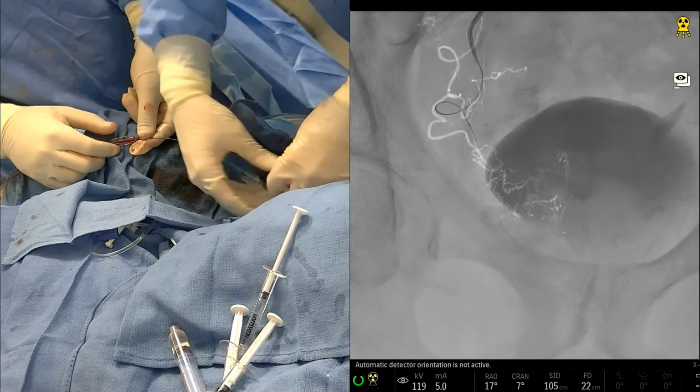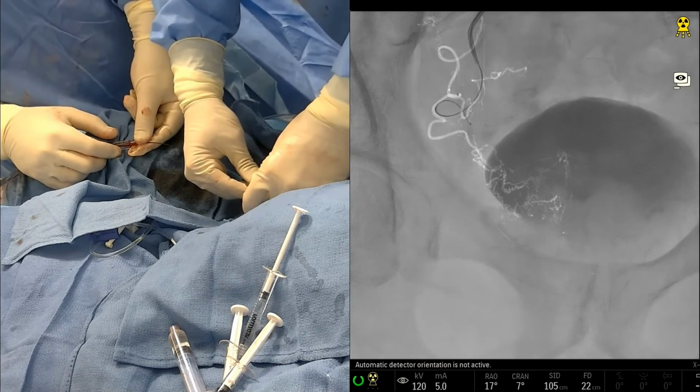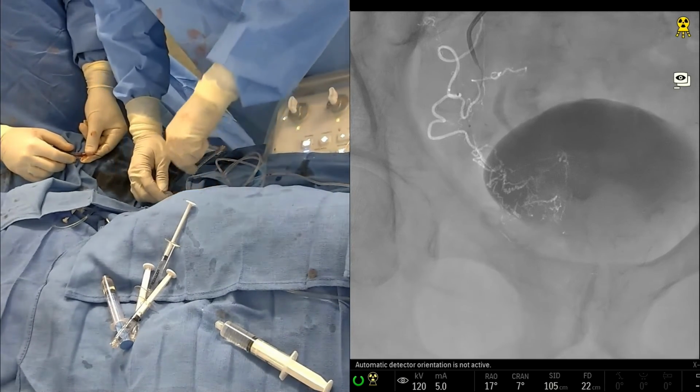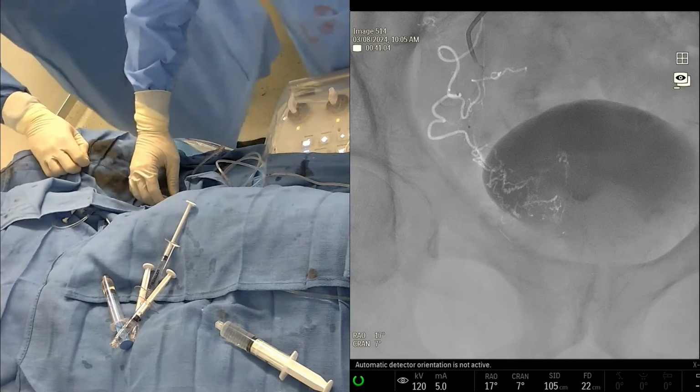You know what? Grab Debbie. Grab the Asahi wire, if we can show that one. That I like for these turns. We don't need a better curve on this. You can also just do a better roadmap because that roadmap doesn't look very accurate anymore.